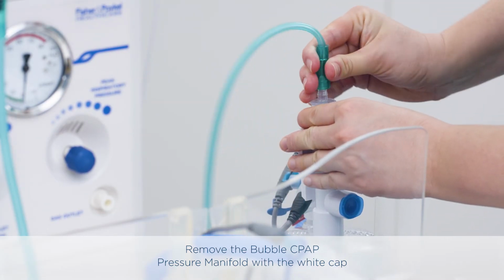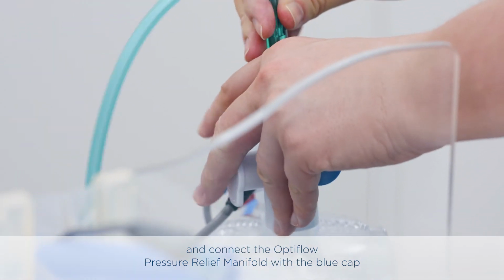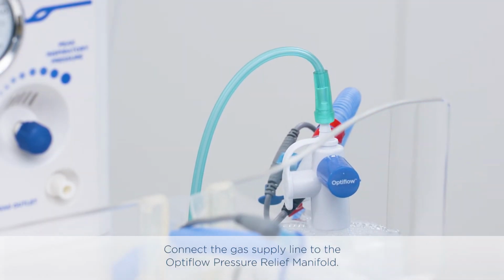Apply pressure relief. Remove the bubble CPAP pressure manifold with the white cap and connect the Optiflow pressure relief manifold with the blue cap to the inlet port of the humidification chamber. Connect the gas supply line to the Optiflow pressure relief manifold.